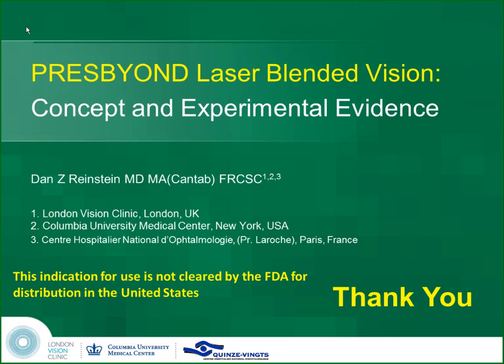My point here is this, and I'll just try and be gentle about this. Putting implants into the cornea, as John put it, is a punishment. Doing LASIK, you can hardly call that a punishment. It's a natural procedure that Barraquer conceived of. It's stroma on stroma. There is hardly any biological inflammation. It heals beautifully. It's stable over decades. Why are we going to combine LASIK with an excimer and then put an implant when you can do it all without an implant? That's my question.